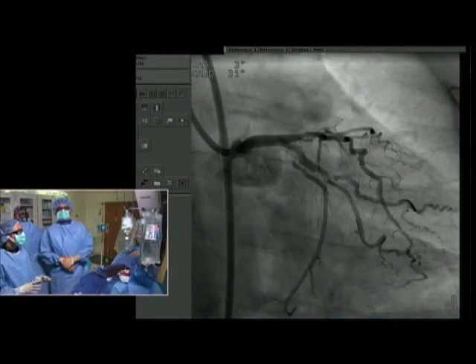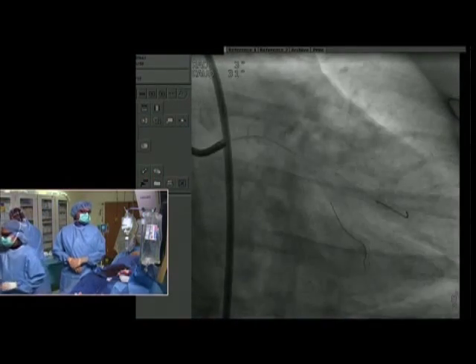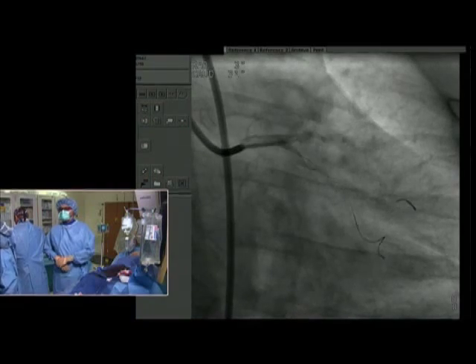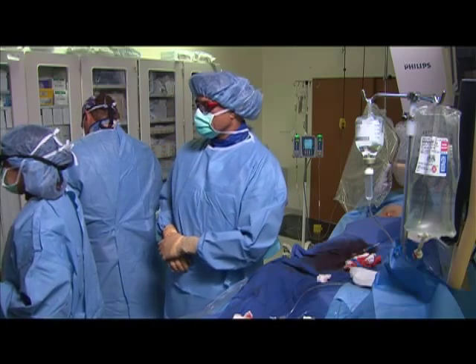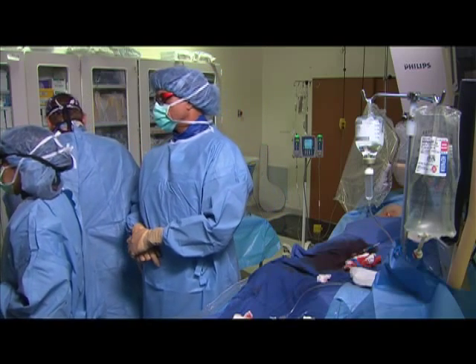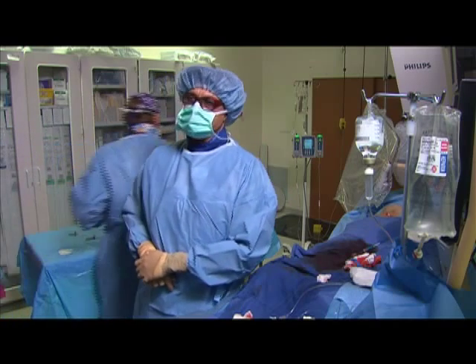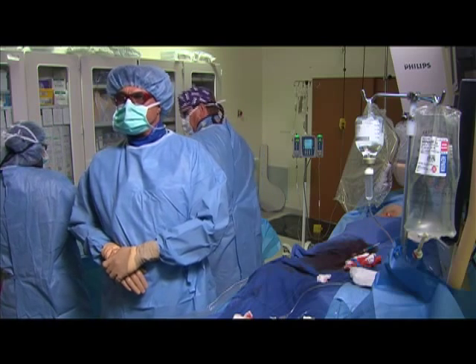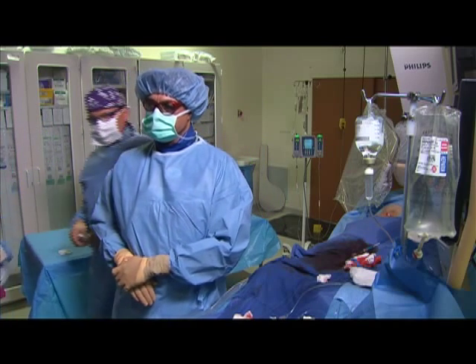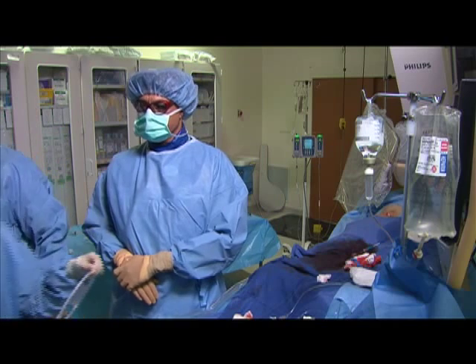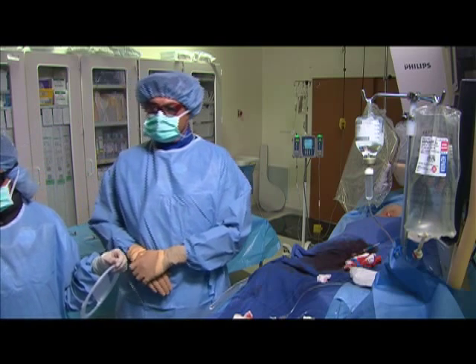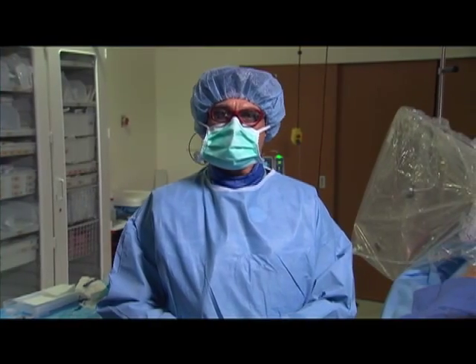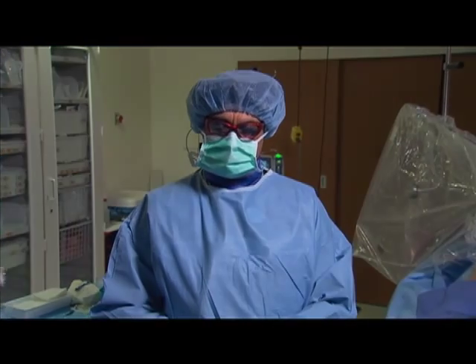This is a very complex lesion involving both branches. We will use a technique called the jail balloon technique, which we have written up and had accepted to TCT this year. This is where we jail a balloon in the side branch, deploy the stent in the main branch, angioplasty to the side branch, remove the balloon and wire, and then post-dilate. That way we do not completely jail any vessel, and we haven't had any occlusions of the side branches with this technique.